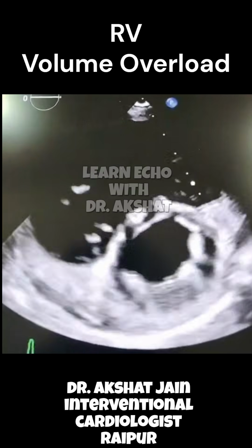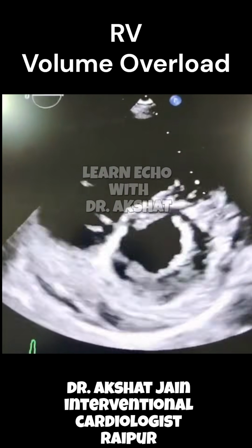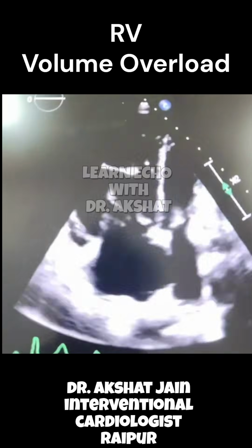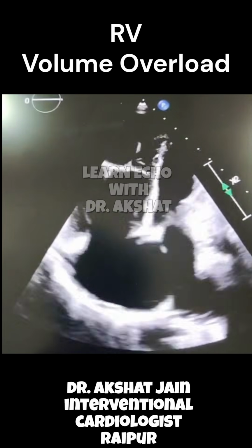So this is a case of volume overload, not a pressure overload. This is again a case of ASD, atrial septal defect. However, in this case, there is no Eisenmengerization and the septum is not getting pressed during systole but during diastole.